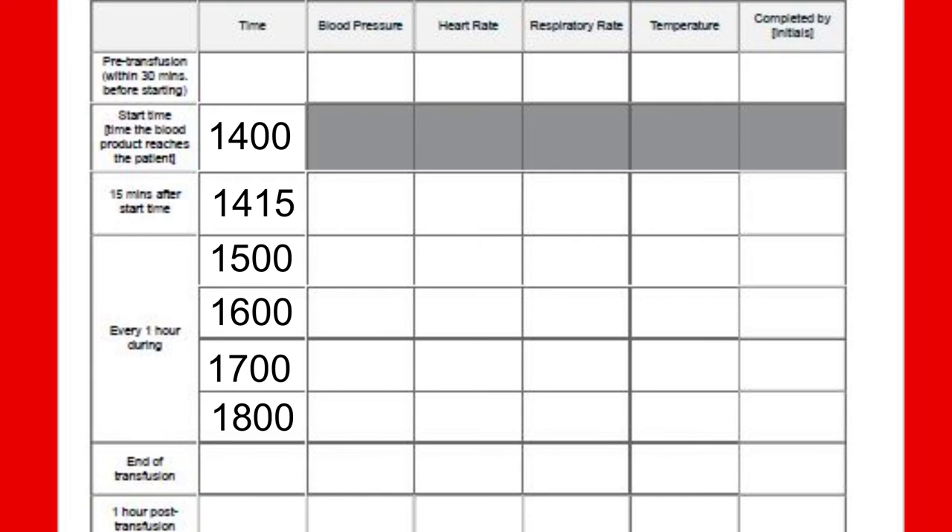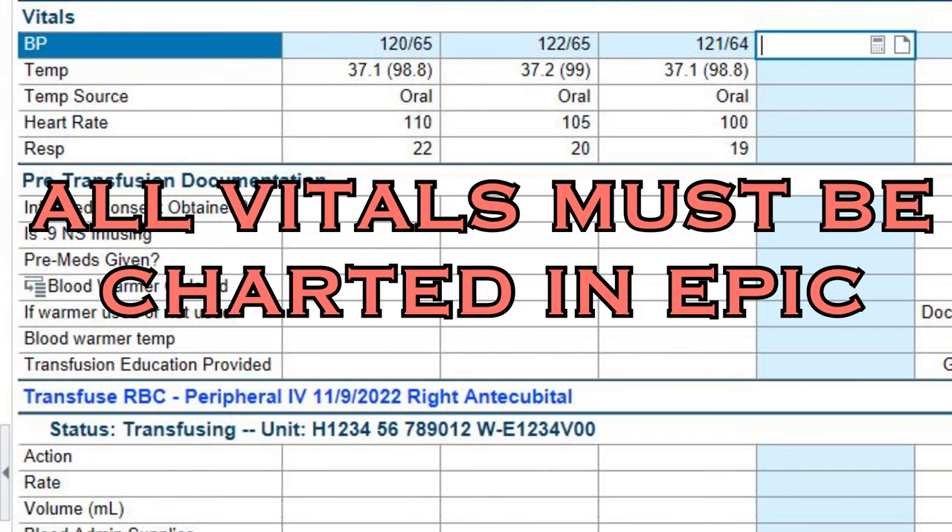Another set will be needed as soon as the transfusion finishes, and then again one hour after the finish time. The vitals can be recorded on this form, but this is just for the easy visualization of trends. The vitals must be transferred into EPIC as well — this form is not a piece of permanent charting. All vitals must be entered into EPIC.